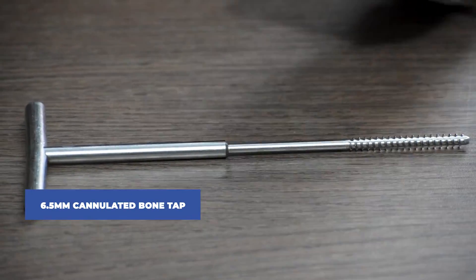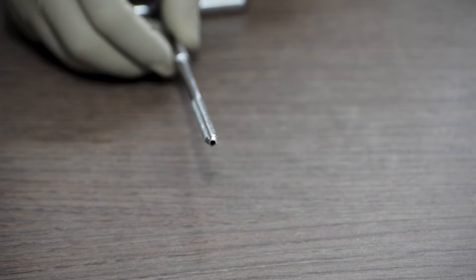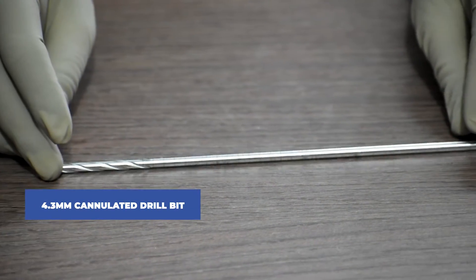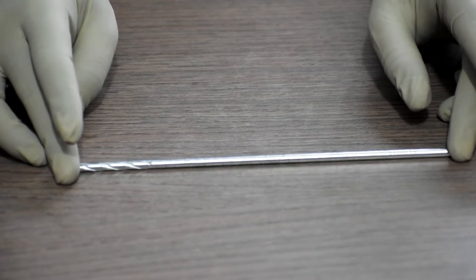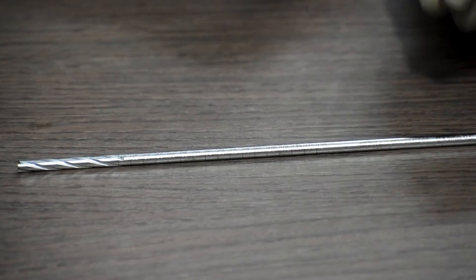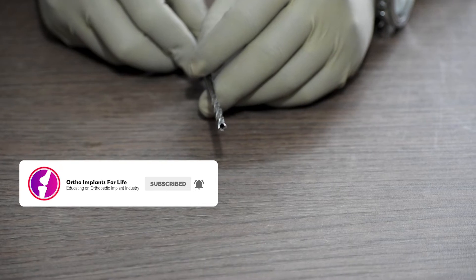Next, a 6.5mm cannulated bone tap is also required. Next, 4.3mm cannulated drill bit is required. It also has got markings in its surface in order to measure how deep it's drilling. See, here it is cannulated.